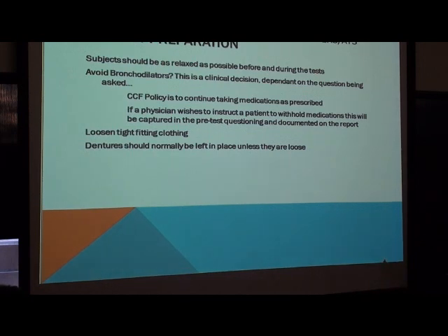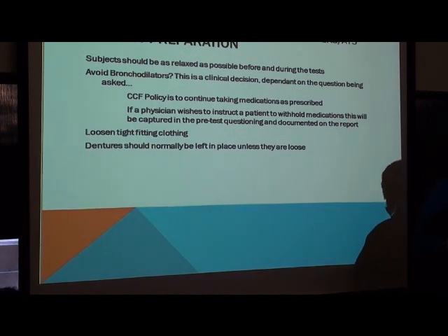But each one of those laboratories had their own policies for how pulmonary function tests should be done. And that's not unusual. All across the country, if you surveyed different laboratories, you'd find that there were slight differences in what their policies and procedures were. In part because pulmonary function is not a very well-regulated industry. But now with the situation that we're in, when we say that we'd really like the results that we're getting to be portable, meaning independent of concern about where the test was done, we really want to adopt a uniform attitude and policy about how we should do things.